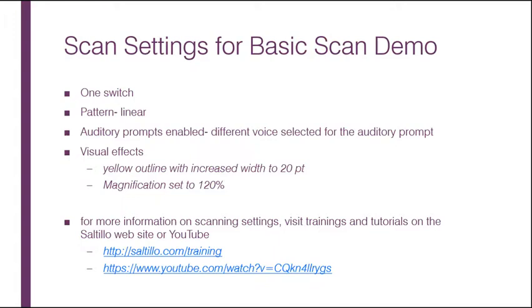Scanning settings for this demo will be set up as follows: scanning is enabled, one switch is selected, the pattern is set to linear, auditory prompts are enabled to speak the label, and a different voice is selected for the prompt. I have also added visual effects to create a large yellow highlight and a magnification set to 120%.